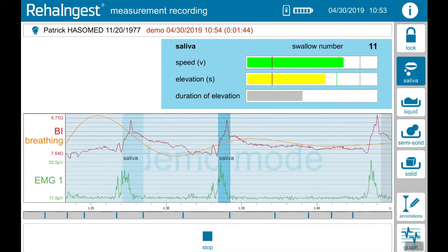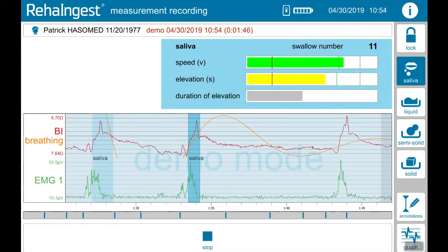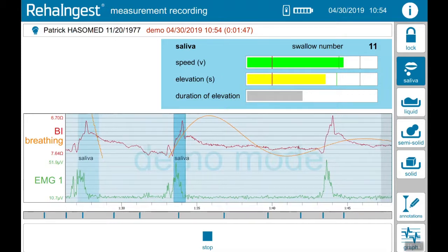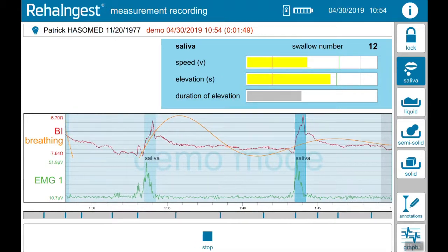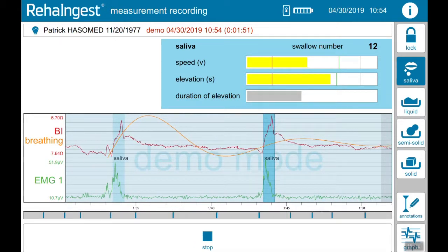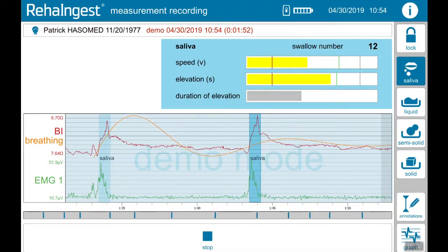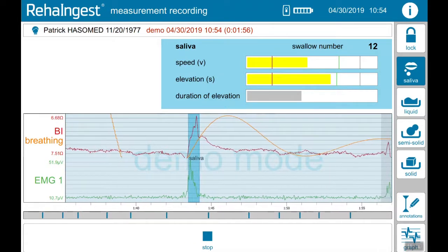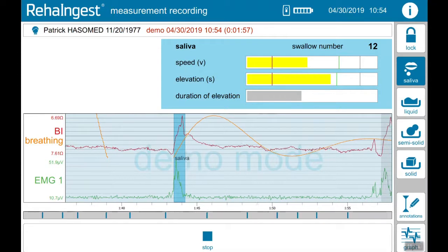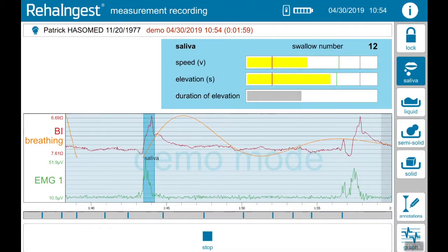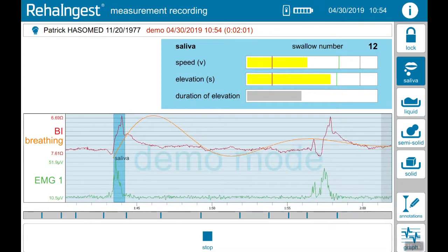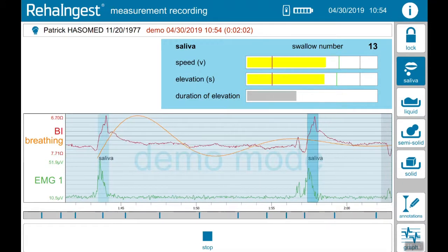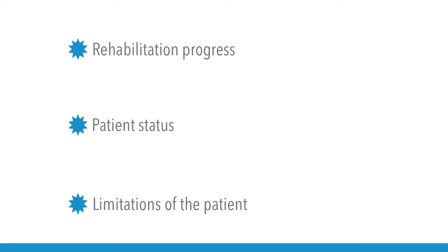The evaluation of each swallow is done in the background. A growing database with thousands of healthy swallows compares each parameter and gives information about the quality. This information about each swallow supports the therapists with data about the progress, status and limitation of the patient.